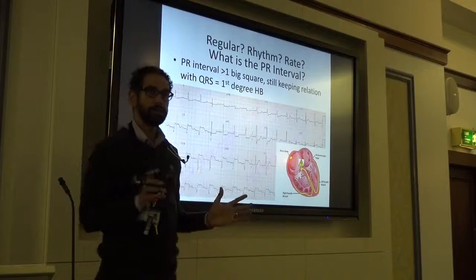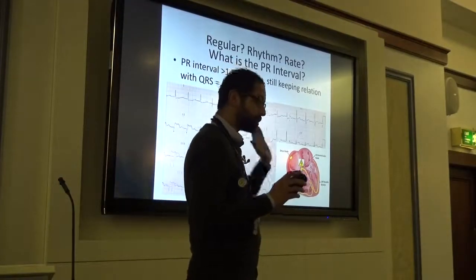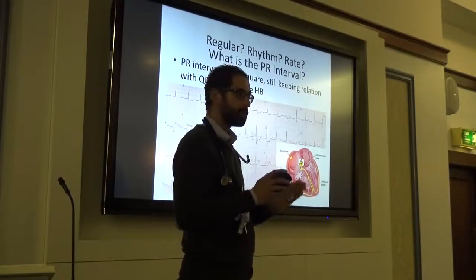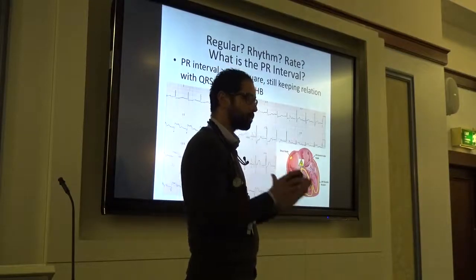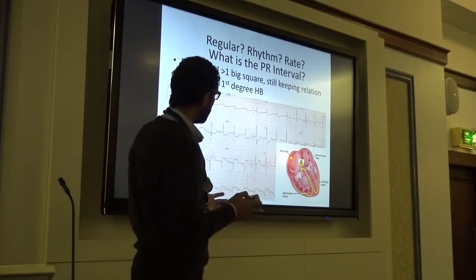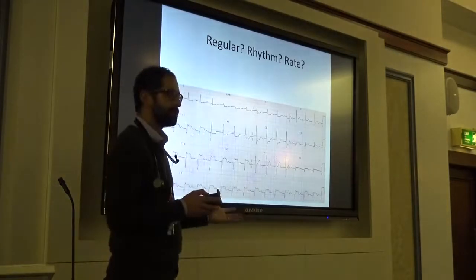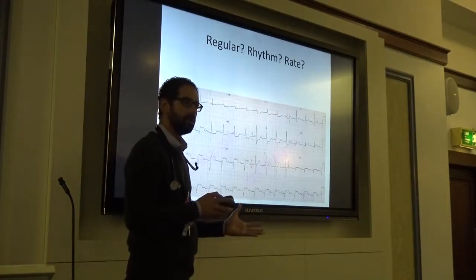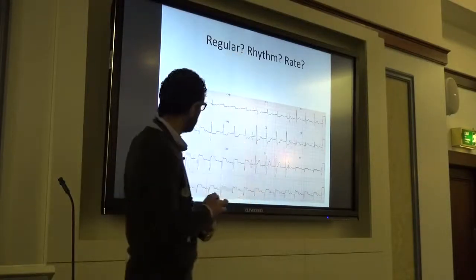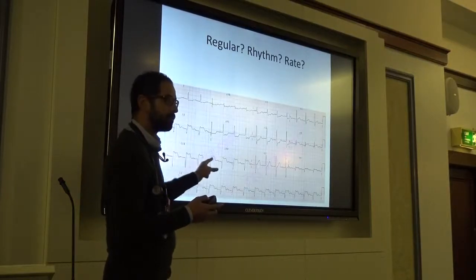So just keep it simple, right? So there might be other things in the ECG, but we're just chunking it away. We're taking one step at a time so that you turn a big, massive task into smaller little chunks and you can get the job done, okay? And obviously now you can then start asking, okay, well, what's the elephant in this ECG? What's abnormal here in this ECG? It's an inferior STEMI. Yeah. And you all see that there's an ST elevation here in the inferior leads.